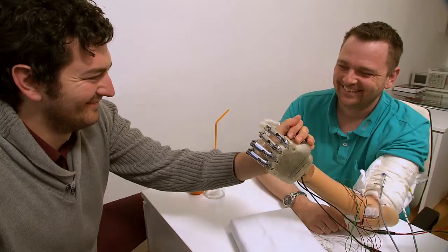My kids, they thought it was cool. They even called me the cable guy. We performed a four-week clinical trial implanting electrodes into the peripheral nerves.